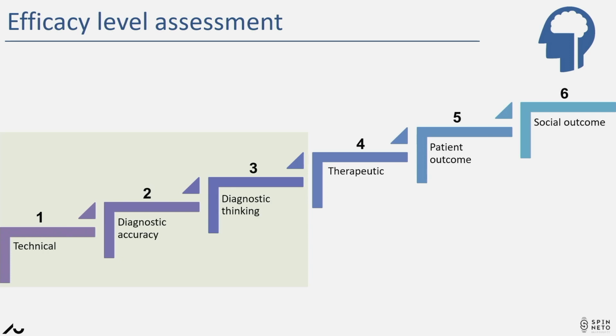Can you get the things that you want? Can you start looking at separating tissues and now disease versus not disease, and can you actually get to the diagnosis aspect? So we're really in this 1 through 3 phase as we're looking at developing technology, and we can say it will be successful if we can make the jump to changing therapeutic decision based on imaging. That's when we say, hey, we have success.